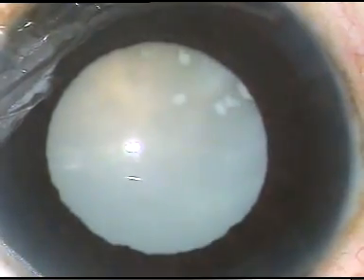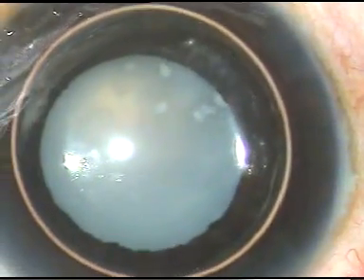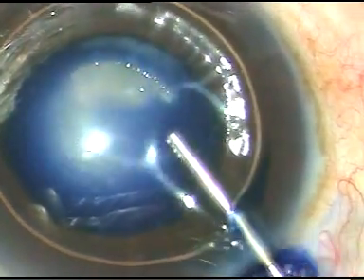I want to stain the capsule with trypan blue dye. A big air bubble has been injected into the anterior chamber, and this is the trypan blue dye 0.06%.